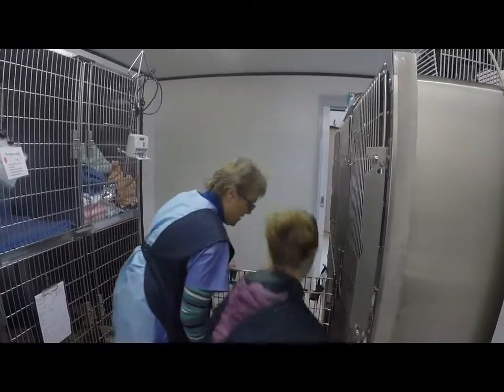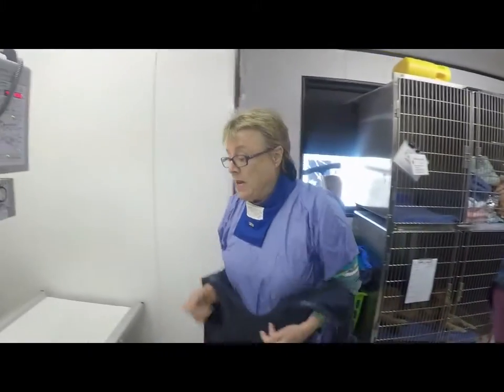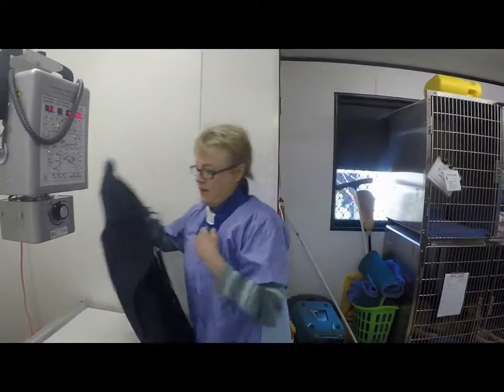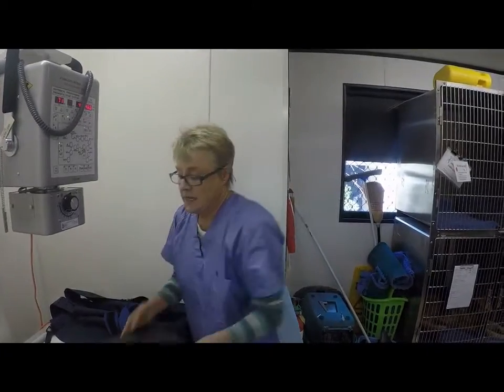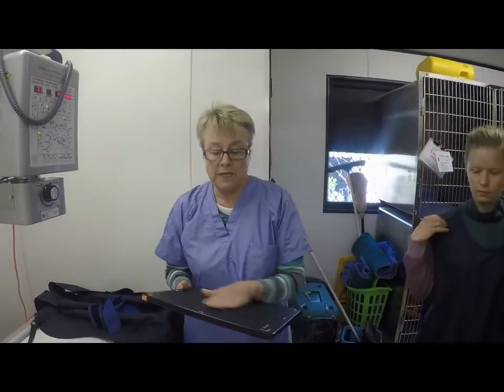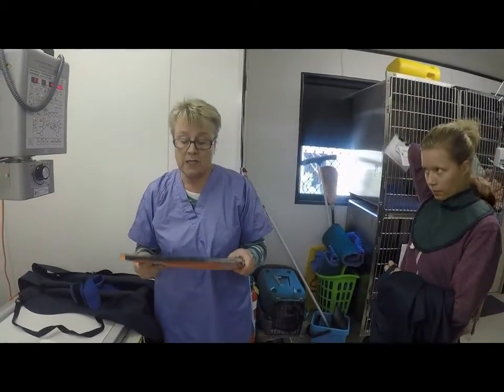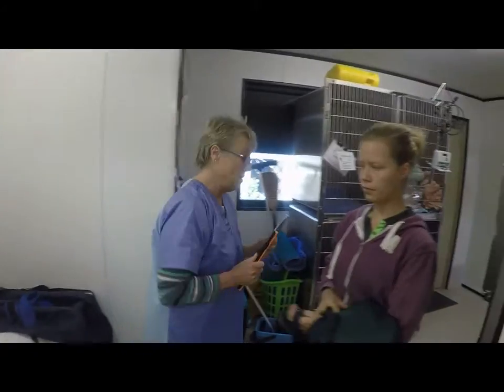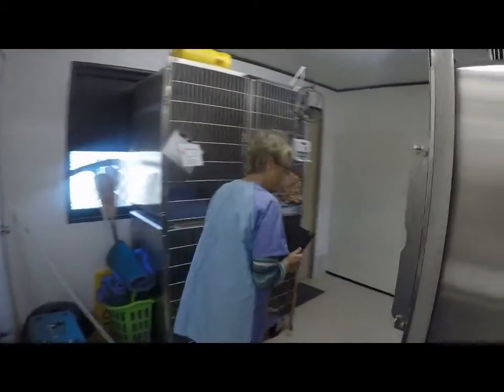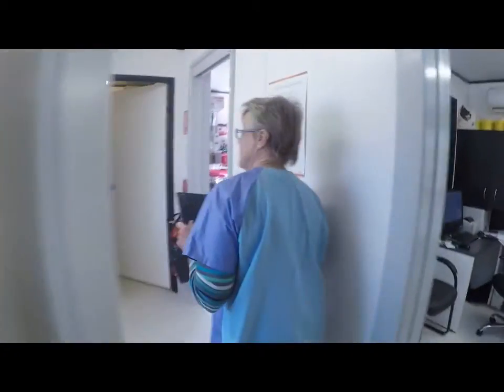And that's fine. There you go sweetie. And now we can get rid of these very heavy lead-lined protective aprons. This x-ray film is the new type of film which has automatic processing without any use for developing liquids.